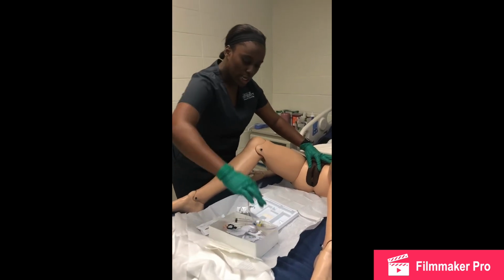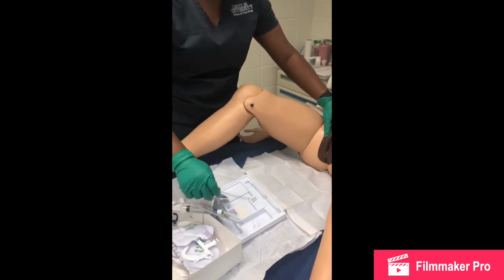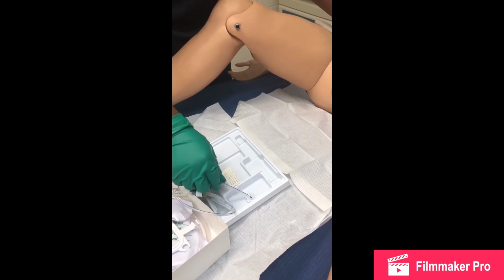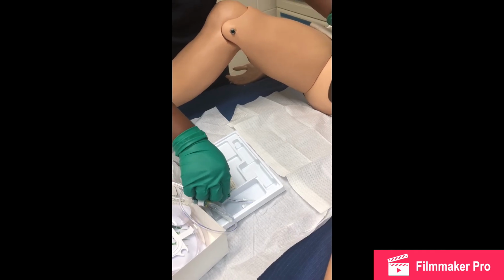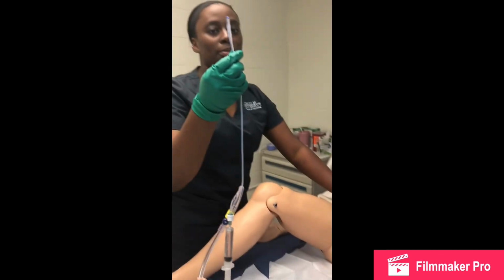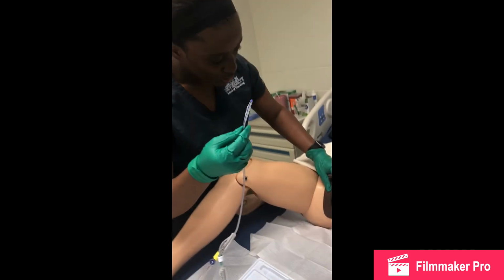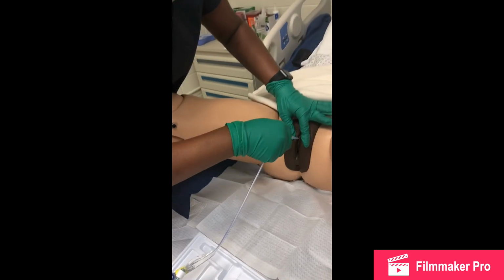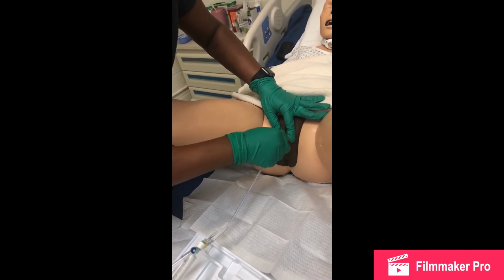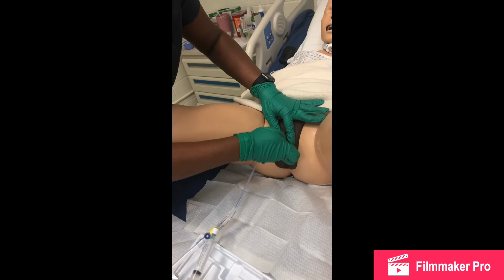So now we're going to lubricate the tip of our Foley. We're going to carefully lubricate without breaking sterility. Now that my Foley has been lubricated, I'm going to tell my patient to inhale, and then while she exhales, I'm going to insert. So I'm going to carefully insert up to 3 to 4 inches until I meet resistance.